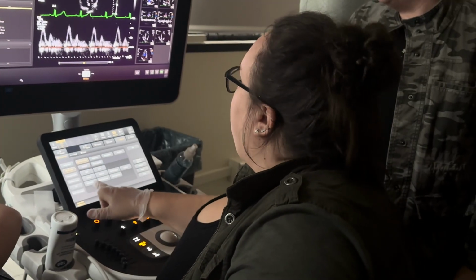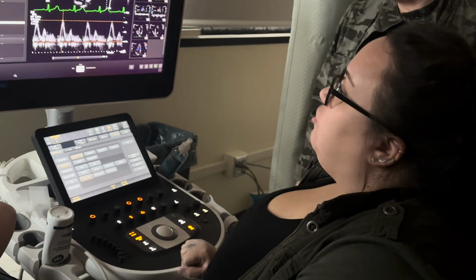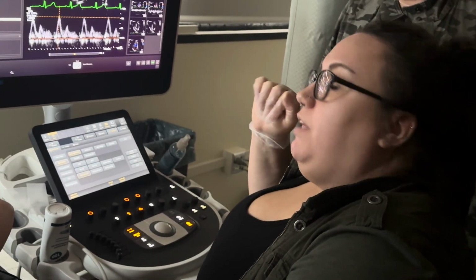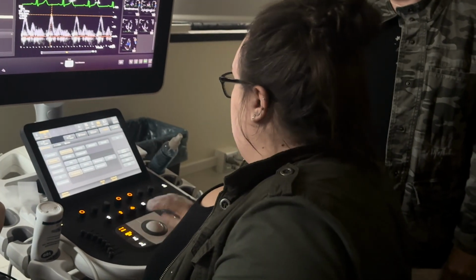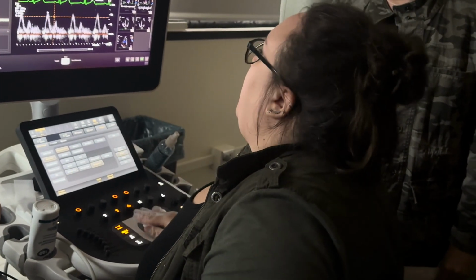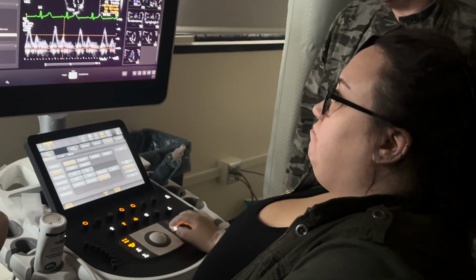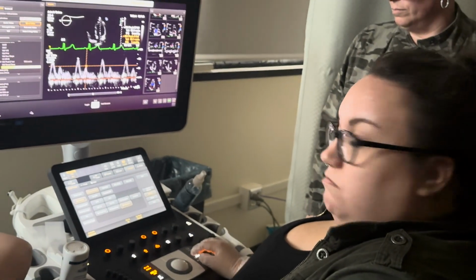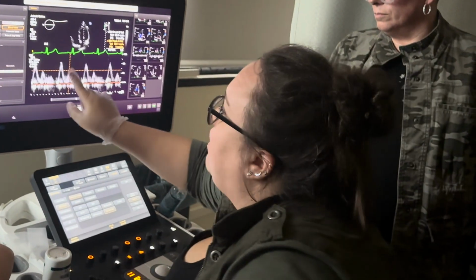All right, you'll hit peak E velocity, which is this guy. So just like what we did with carotids with that peak systolic velocity, we're measuring our peak E wave velocity. And then you hit the A wave and you do this little A wave velocity. Very similar to carotids, but instead of a peak systolic and end diastolic, we are measuring these 2 points.